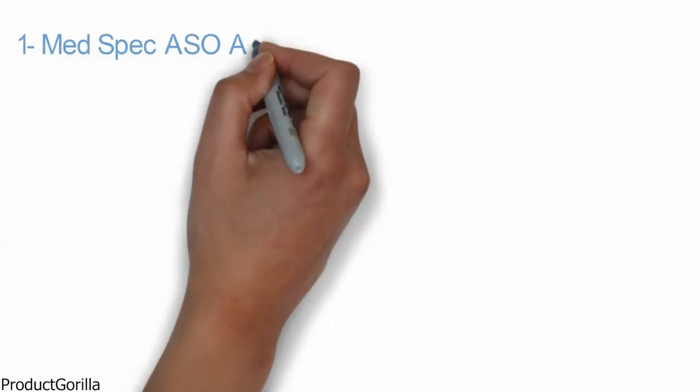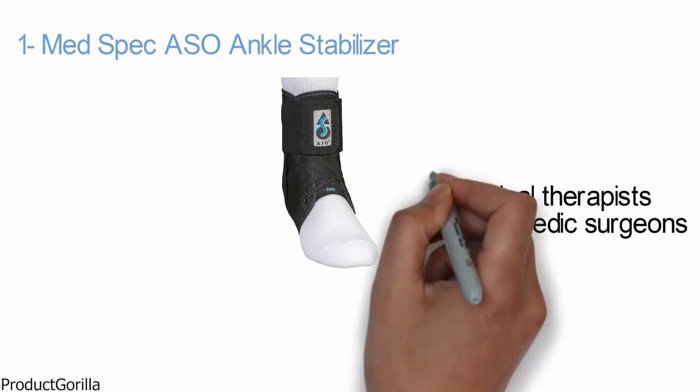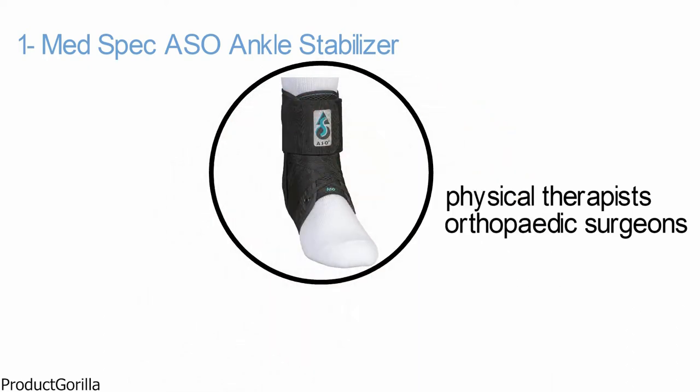At number one, we have the MedSpec ASO Ankle Stabilizer. The ASO is one of the most recommended ankle supports by athletic trainers, physical therapists, and orthopedic surgeons due to its high quality and a unique combination of comfort, support, and durability.